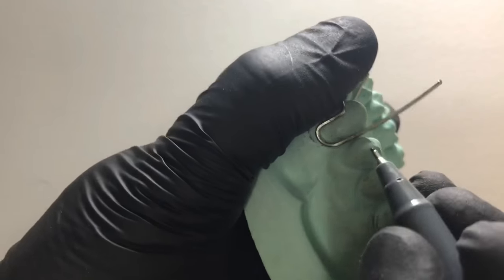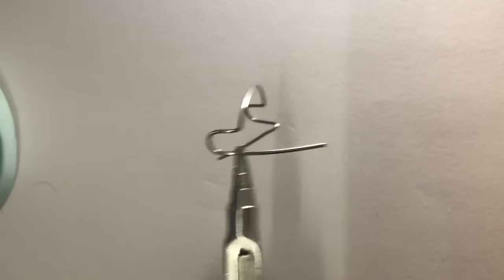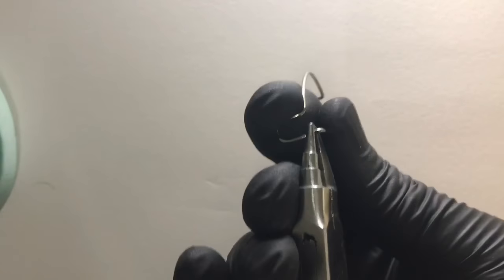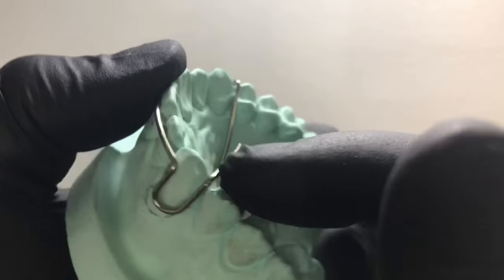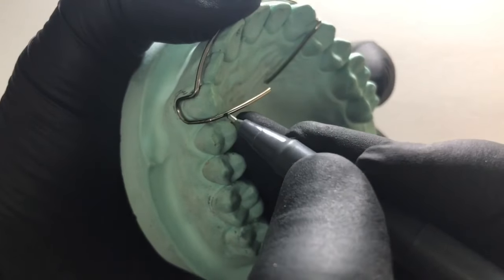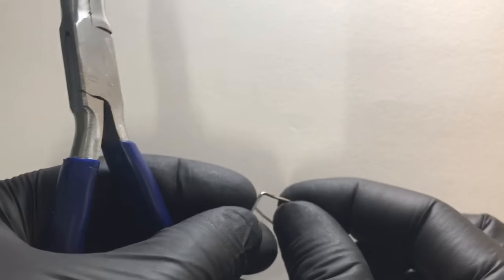Now again going for the opposite canine, marking the embrasure point and giving a first 90-degree bend, keeping the plane exactly the same. Two to three mm — we can first check like this. If we are into the correct aspect — yes, we are. Now we need to open this bend, so slightly away from the embrasure point we need to first open this free end bend before giving a complete 180-degree bend.